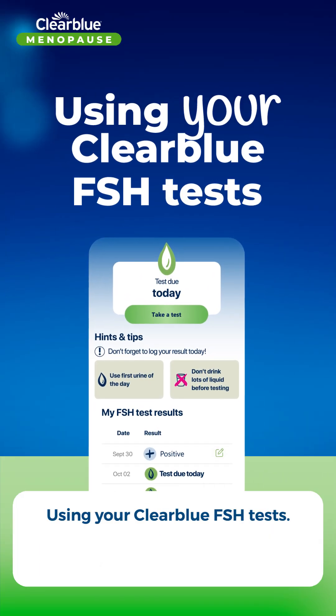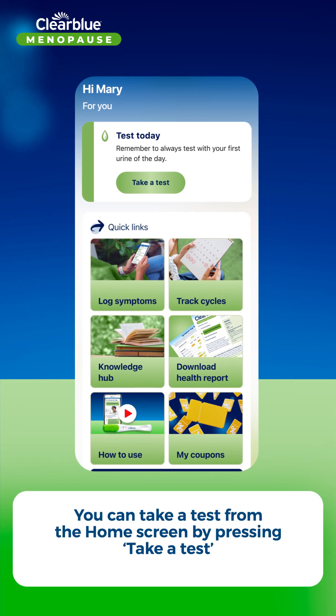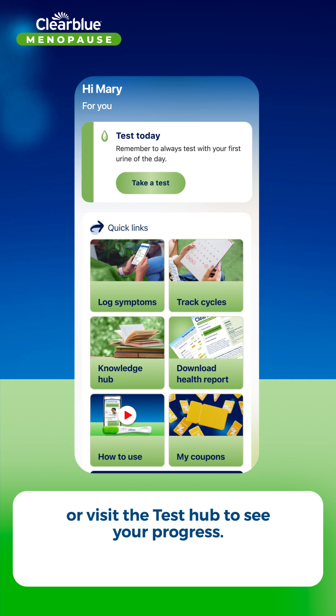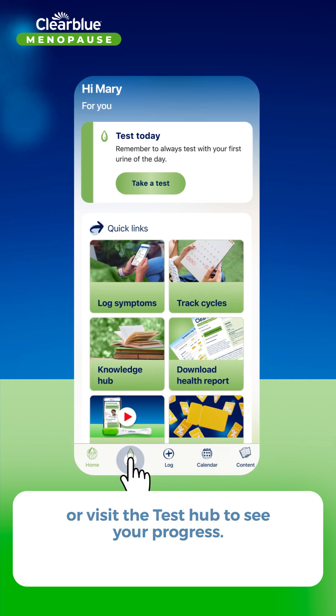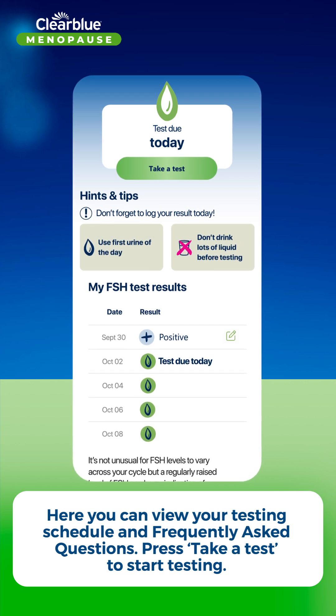Using your Clearblue FSH tests, you can take a test from the home screen by pressing 'Take a Test', or visit the Test Hub to see your progress. Here you can view your testing schedule and frequently asked questions.